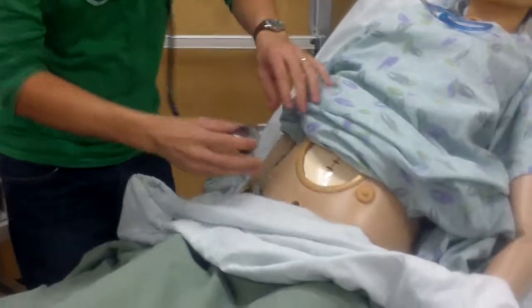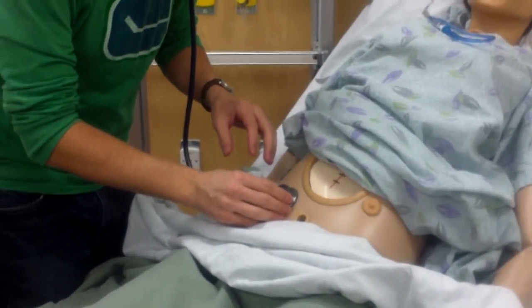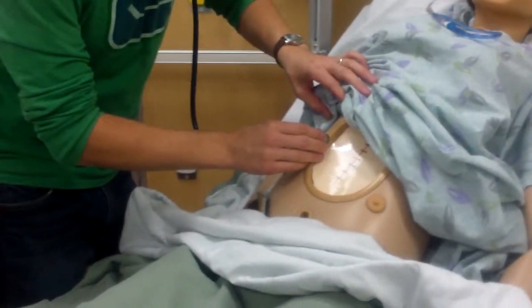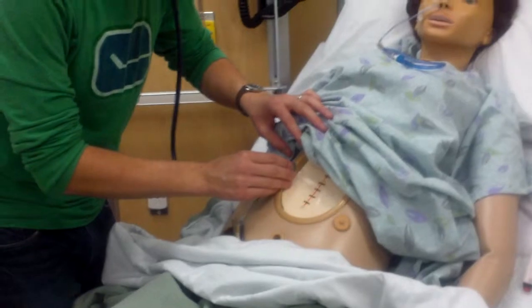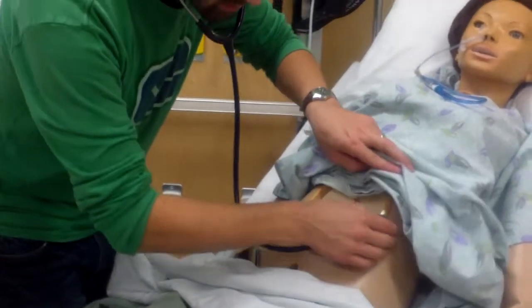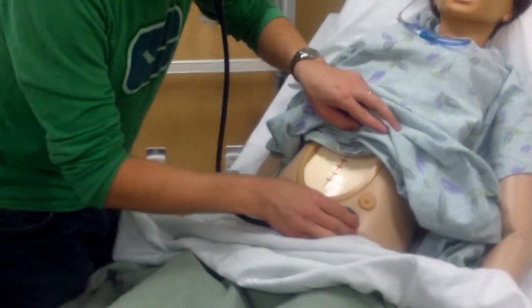Okay. Using the diaphragm, I'd start in the lower right quadrant, and I would listen for at least 15 seconds. Make sure I hear bowel sounds. If I did not hear any bowel sounds, then I would listen for a full minute, up to 5 minutes total. A minute each quadrant, that is too. Okay, there's bowel sounds. Hearing bowel sounds, okay.